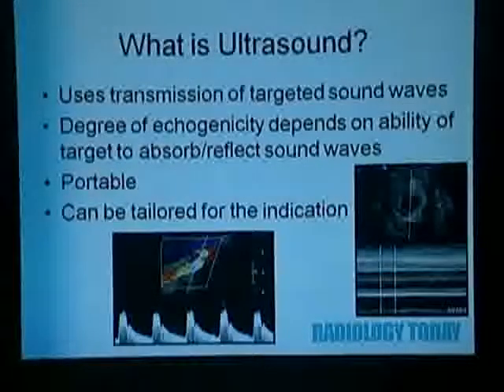So how about ultrasound? Again, ultrasound uses transmission of targeted sound waves. The degree of the echogenicity that we perceive on images depends on the ability of our target to absorb or reflect sound waves. The unique aspect of ultrasound is that it's portable, and like our other studies, it can be tailored for the indication.